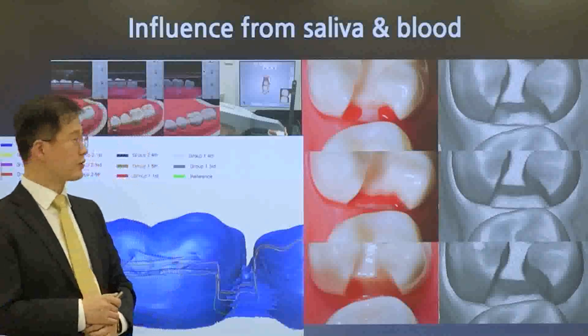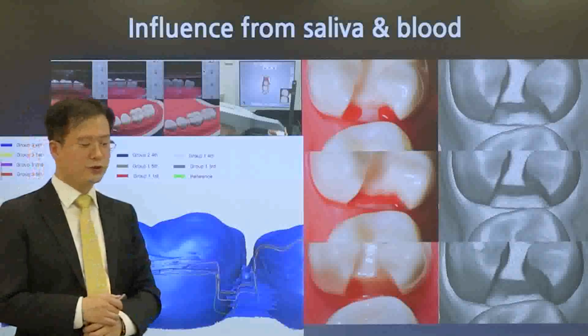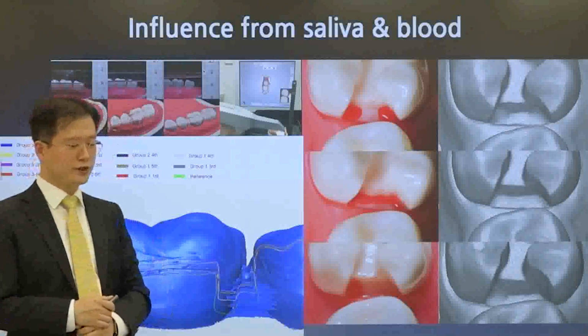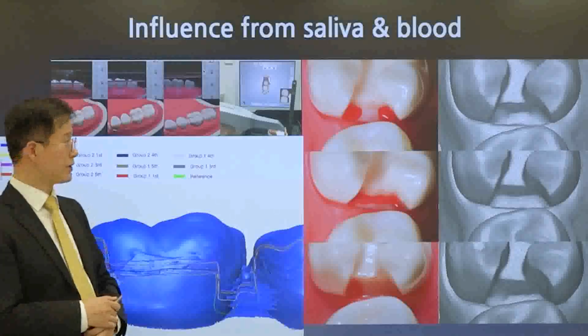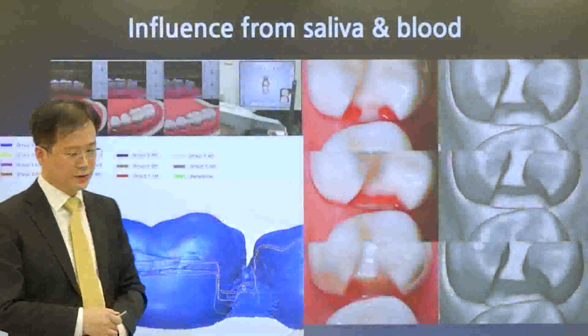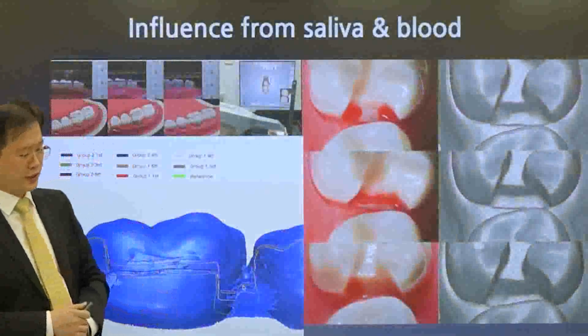Just as the coins in the pond appear to be closer than they actually are, if you fail to remove saliva before you acquire an intraoral scan from the abutment teeth, then you may get data that differs from the actual depth.